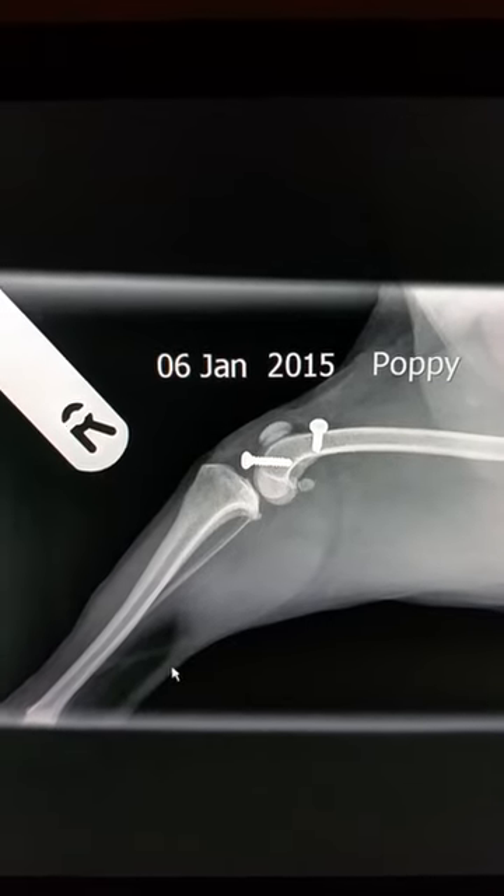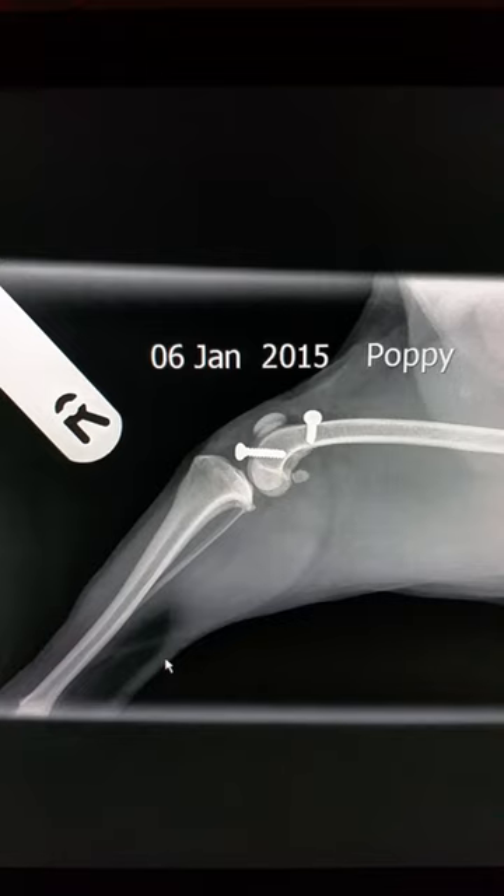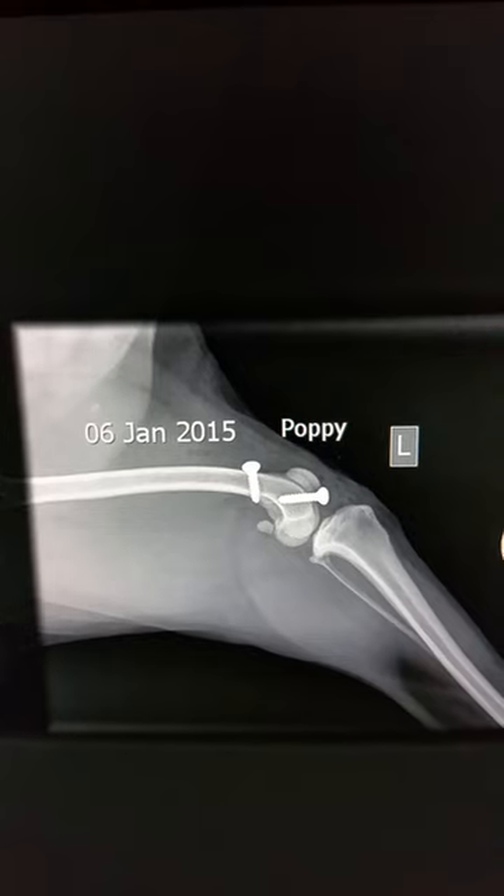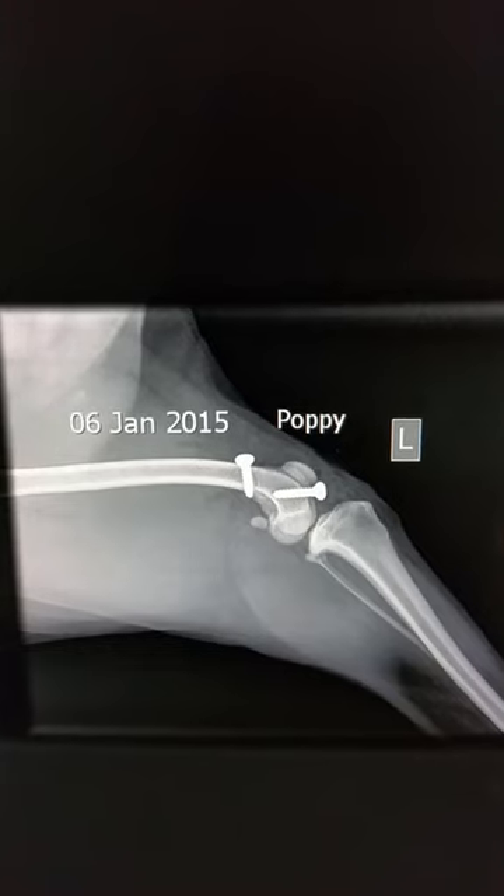This is the right leg, and this one is the left leg.